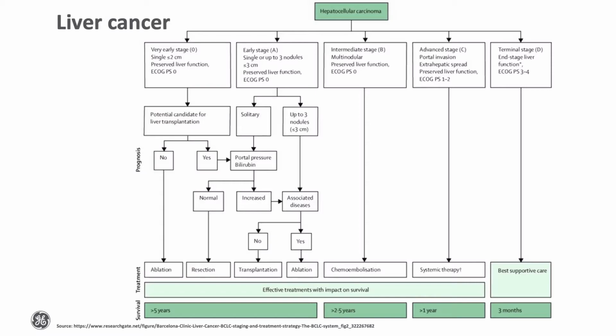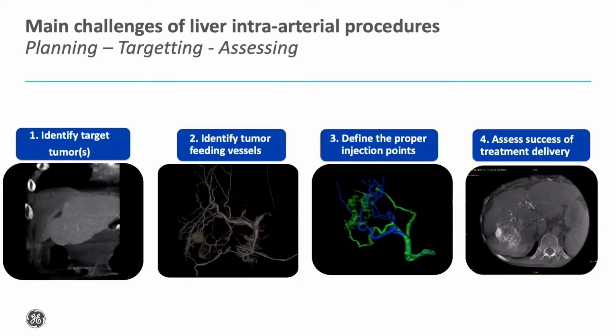So say you have a patient that has an indication for intra-arterial treatment, say for instance chemo, and you will face several challenges that you need to address because you want to plan, you want to target and assess what you are going to do.